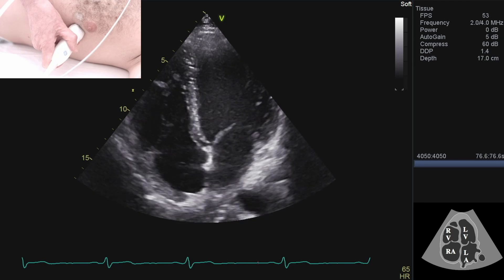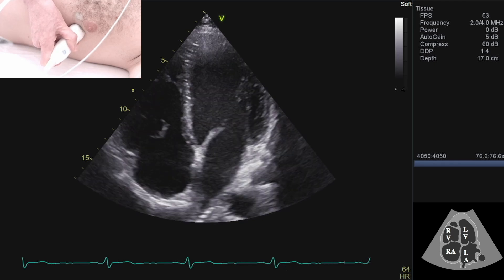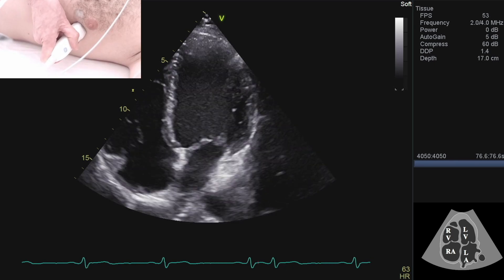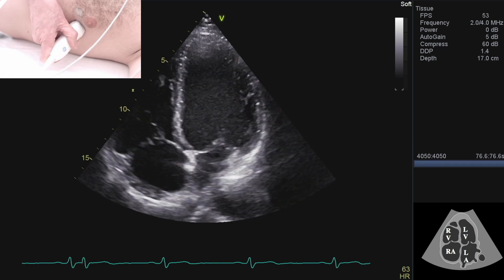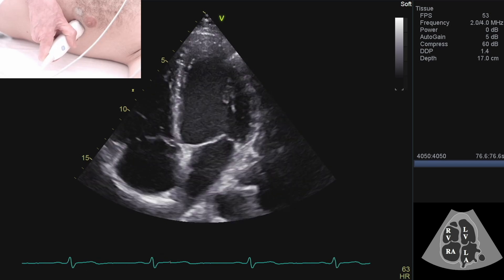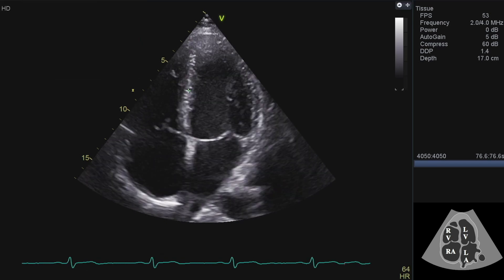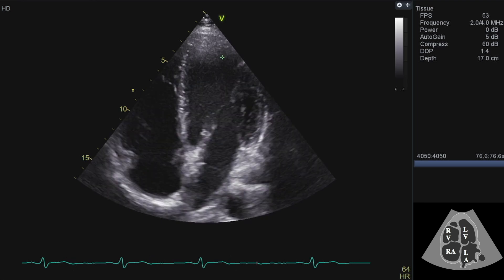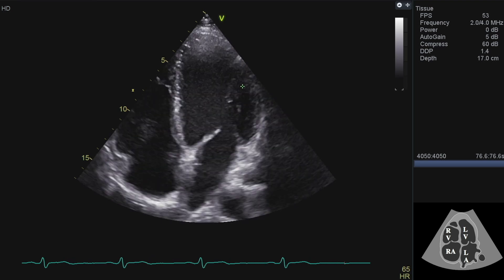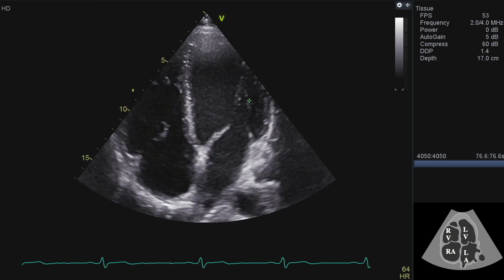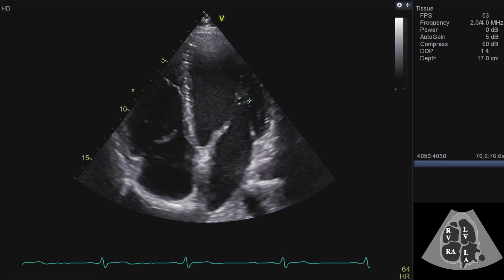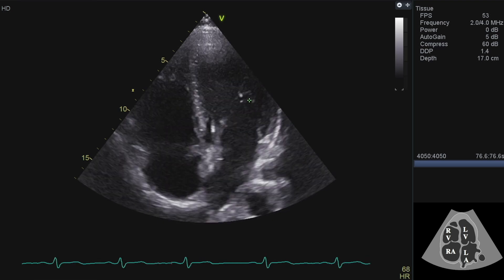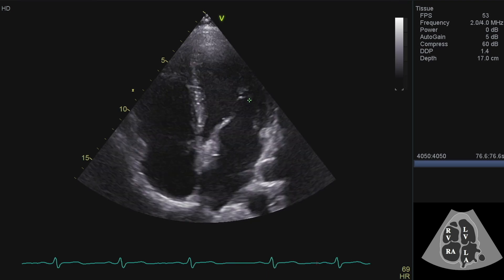Having looked at the right ventricle, I'll slightly move my probe to bring the left into view. It's a nice view to look at the function of the ventricle — how the walls are all moving in, and whether they're moving in similarly. I can assess the valves really well here, so the tricuspid and the mitral valves.